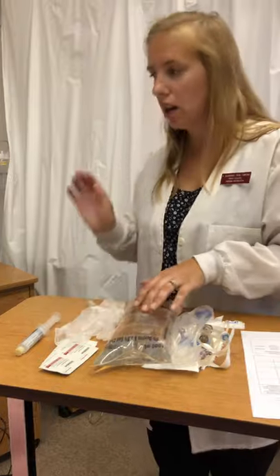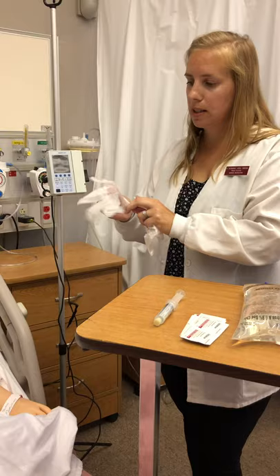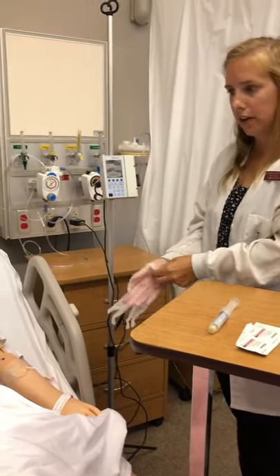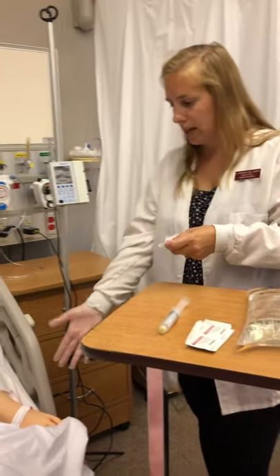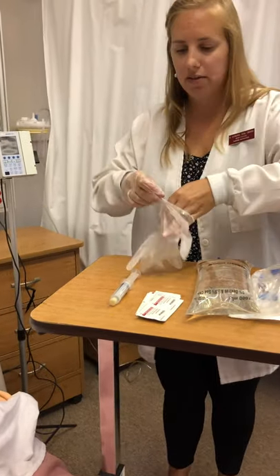I'm going to knock on the door with hands washed, introduce myself to the patient, explain the procedure, and assess for allergies again. I make sure I have the right patient by asking her name and date of birth. I've done all my checks and all my rights.